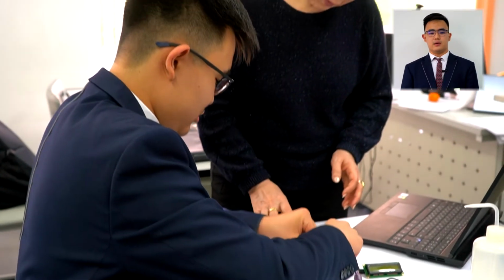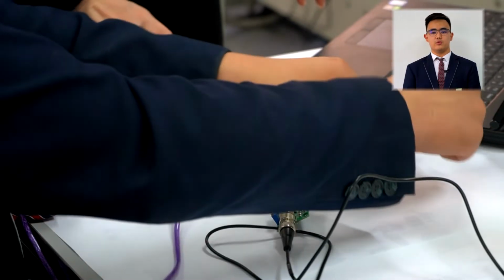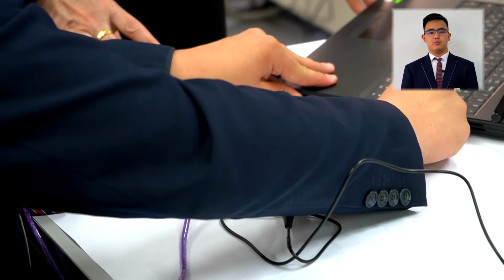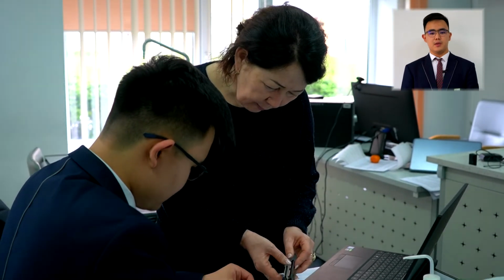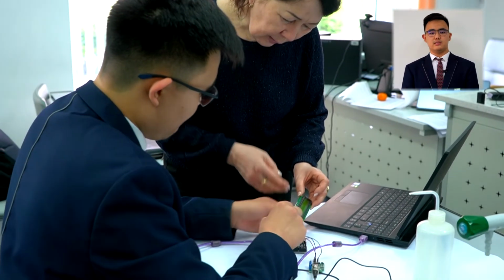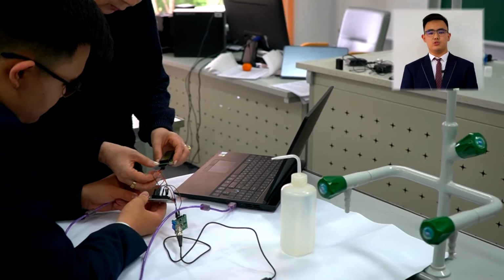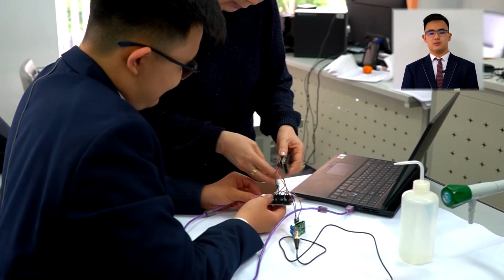As a result, an analyzer was obtained consisting of Arduino Uno 3, LCD display plus I2C, and a pH sensor to measure nicotine in saliva, which can be used both in medicine and to test for nicotine use when applying for a job, because many employers limit tobacco use in the workspace.